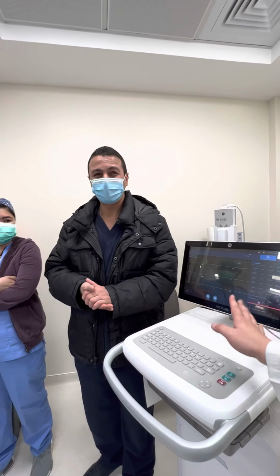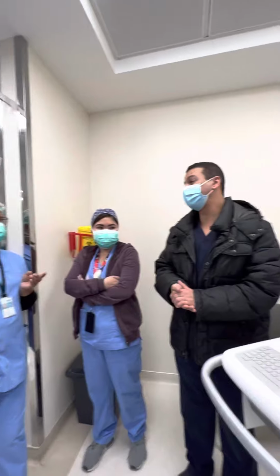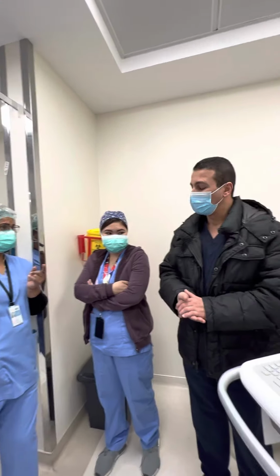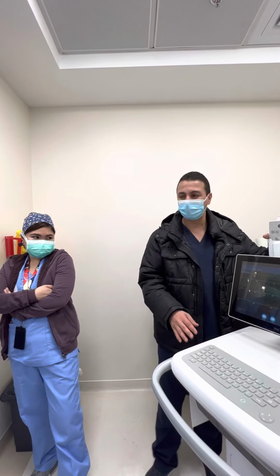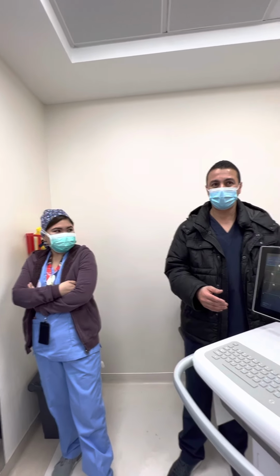So mainly in this machine, the 15 lead, where will we get the extra leads? Check with your biomedical team. Mostly they will ask for this 15 lead, because I know this one is only attached with the 12 leads. We delivered the extra 4 leads with the machine, but it seems they put only the 10 leads. Especially in the resuscitation area, they need 15 leads.